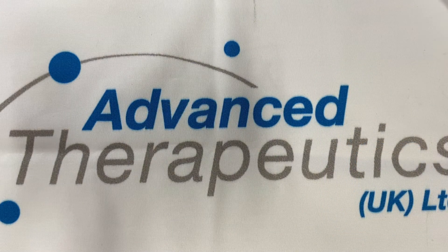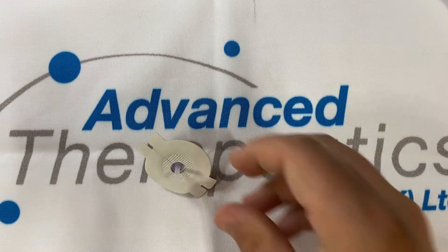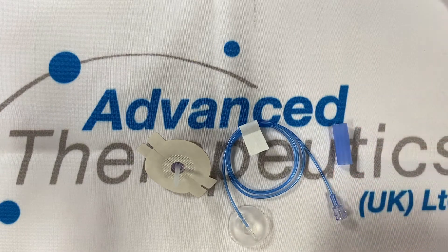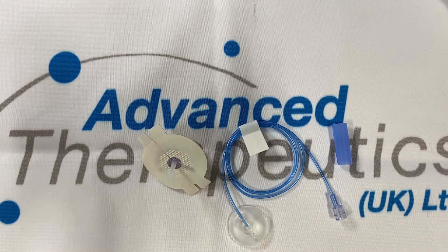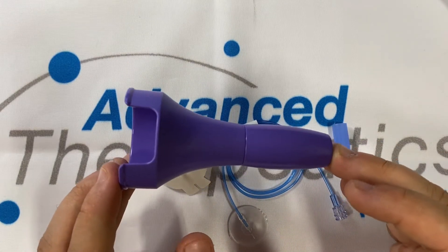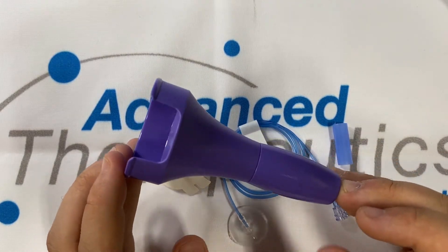Using the Sofrily So infusion set is easy and grants you loads of practical features. In each infusion set package you'll find a cannula, some tubing and a small blue cylinder that comes in really useful when using the inserter. The inserter looks something like this and makes it really practical to insert and get a 90 degree angle every time.